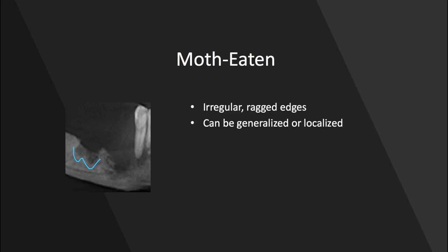We can also have a moth-eaten radiolucency. In this case, it's hard to trace — these edges are ragged and irregular — and moth-eaten is a pretty appropriate description. They can be generalized and affect a wide portion of the mouth, but in this case it's more localized to one specific region.